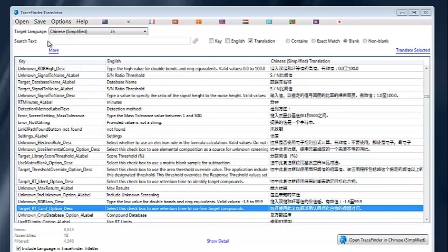So basically, the task that the TraceFinder Translator does is generate localized resource translations. It also uses Google Translation to auto-translate some text as a first pass, which can then be adjusted by an end user who may know a better translation or a domain-specific translation. It also allows translations to be saved into a file and shared with other users. And eventually we'll have those available on mytracefinder.com for download for use by any end user who wants to apply a translation that another user has created.